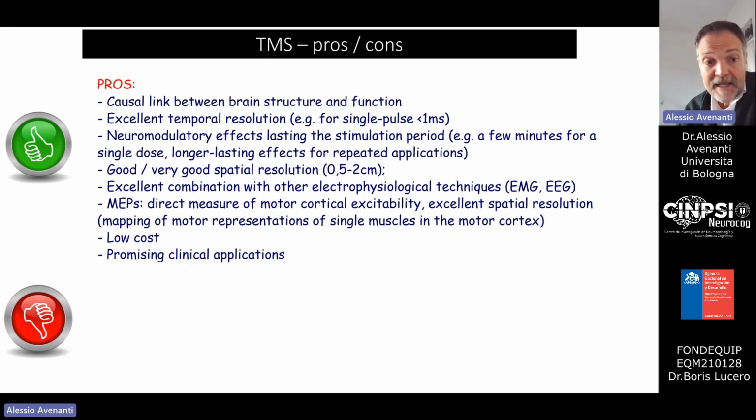TMS can provide an excellent combination with other techniques, like electromyography, if we are interested in recording motor evoked potentials, or electroencephalography, if we're interested in TMS evoked potentials. These are quite important, informative measurements.